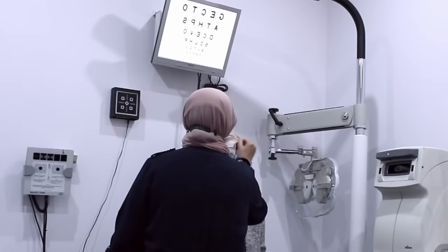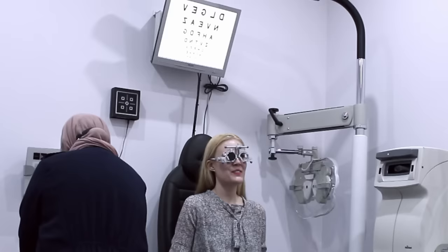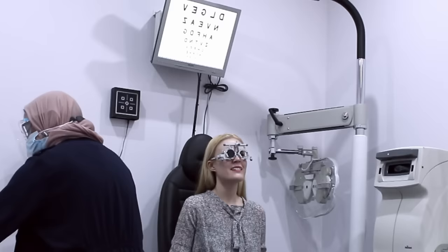So again, this is without the prescription on. Oh, gosh. It's a bit weird, isn't it? Can you see the top at all now? D, D, L, G, E, V. Bit more difficult, isn't it? Yeah, it's really so blurry.